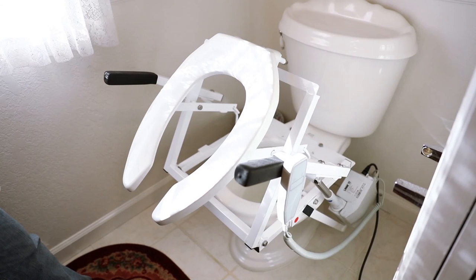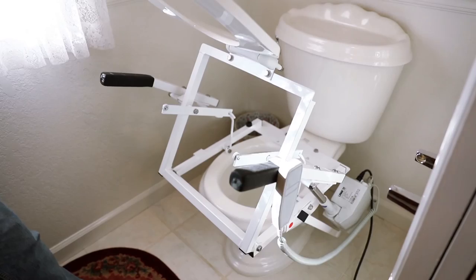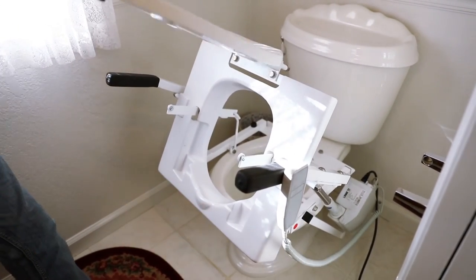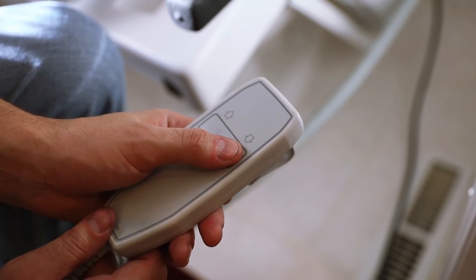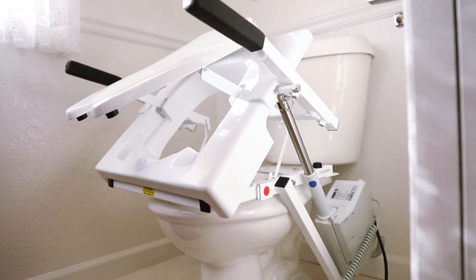Use a soft cloth with warm water and mild soap to wipe the shield down. Refer to the instruction manual for further cleaning details. Once the shield has been cleaned, you can reinstall it by placing it forward, then downward in place on the frame. Using the push button control, lower the tilt into its down position and it's ready to be used.